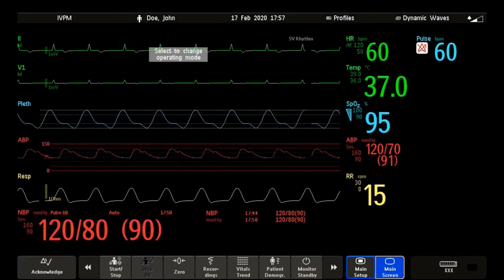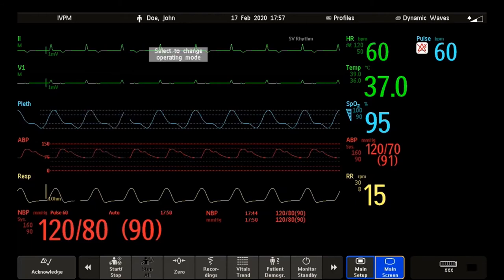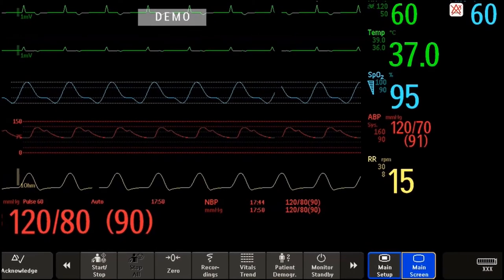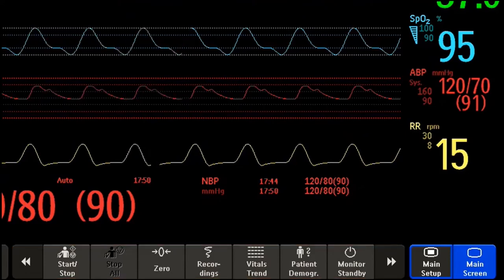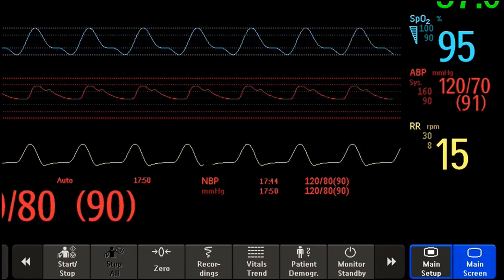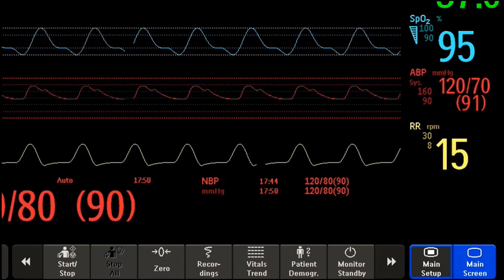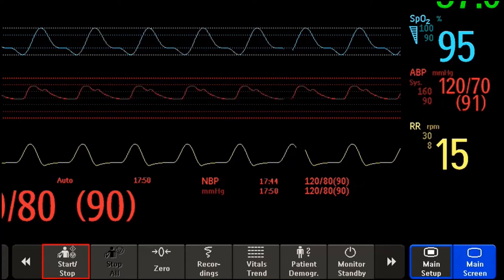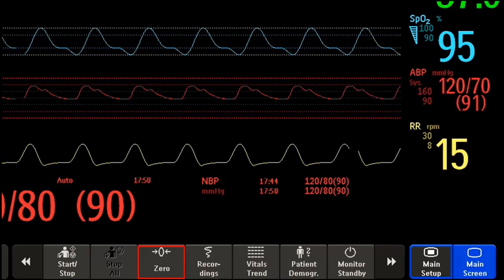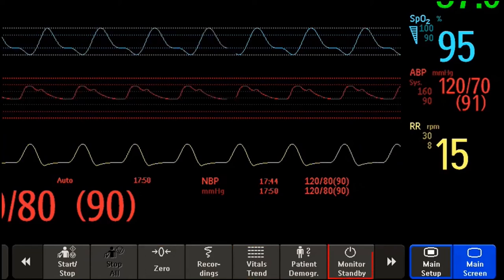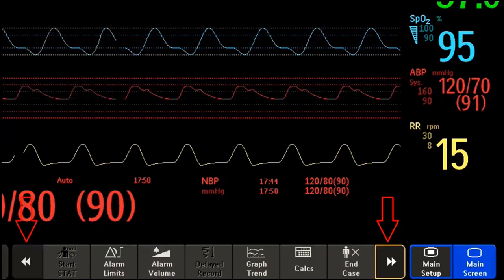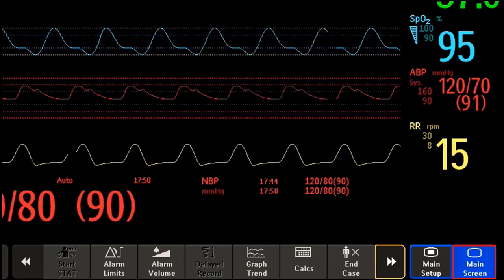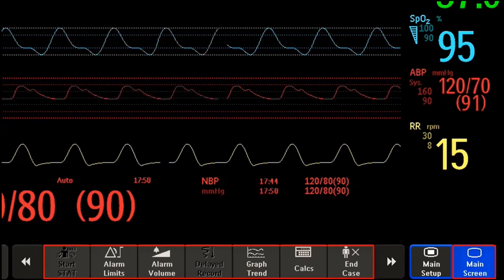I would like to tell you a bit more about the screen keys. Smart keys give you fast access to functions. The selection of smart keys available on your monitor depends on your monitor configuration. Here are some examples of common smart keys: start or stop a non-invasive blood pressure measurement, zero an invasive pressure measurement, view trends, and put the monitor in standby mode. When I scroll to the left or right, I can find even more smart keys. When I use the main screen key, not only do the open windows on the screen close, but the smart keys from the first row are displayed again.